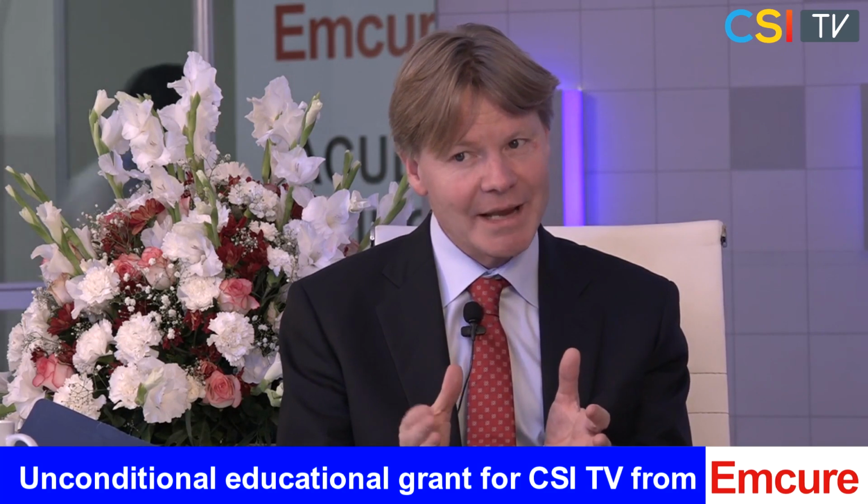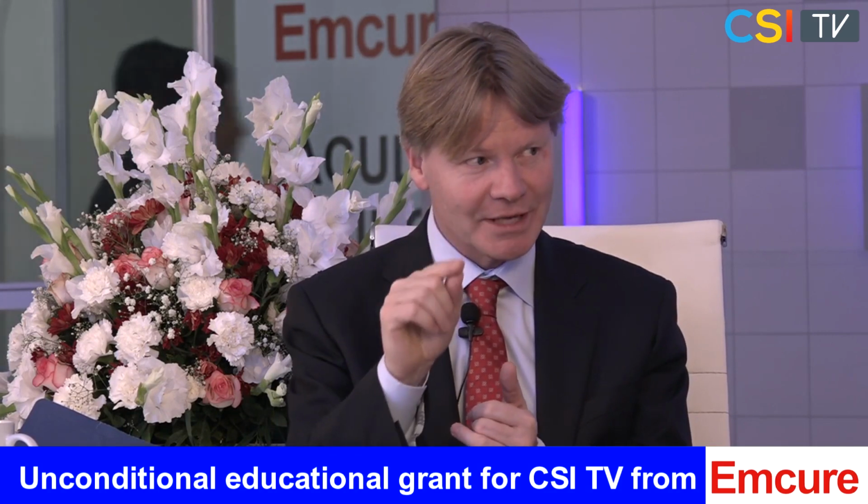So the ventricle dilates, dilates, dilates. At some moment the ventricle cannot handle it anymore and becomes too stretched, so fibrosis is going to be formed. These two are excellent examples of where T1 mapping can help us see if this ventricle is still okay or too much fibrosis is coming. Late gadolinium is visual, what you see: the white, dense, macroscopic scar.